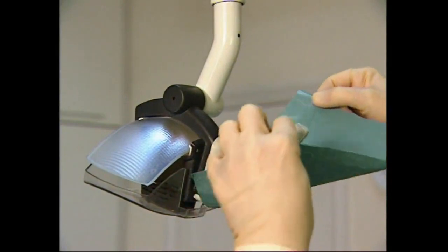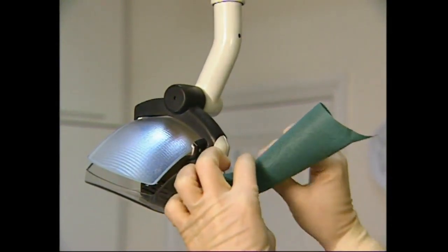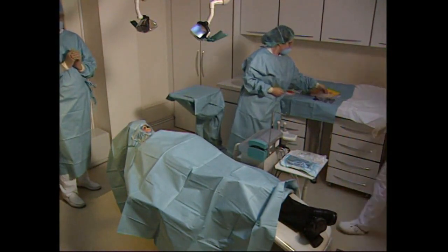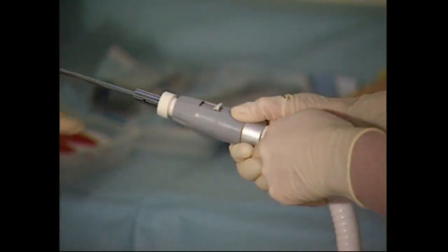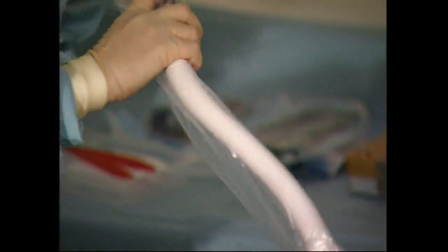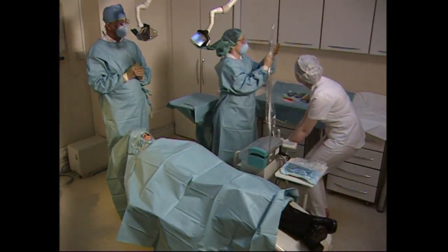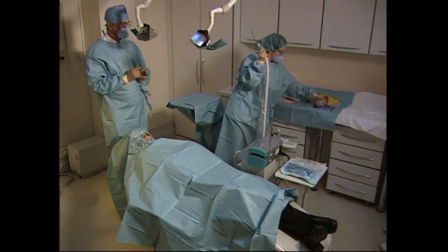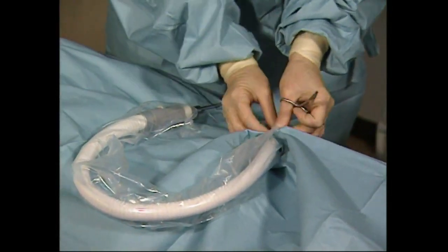The light handle covers are placed over the light handles, making sure the surgical assistant does not touch the non-sterile light. This allows either the surgeon or the surgical assistant to adjust the light during the procedure. The basic principles established to maintain the barrier between the sterile and non-sterile environments are used to drape the suction tube. The roving assistant holds the tube. The surgical assistant attaches the suction tip to the tube and slips the sterile clear sleeve over the suction tip. The roving assistant holds onto a portion of the folded end and feeds the tube in. The surgical assistant then secures the tube to the patient's drape using holders which do not perforate the patient's drape.